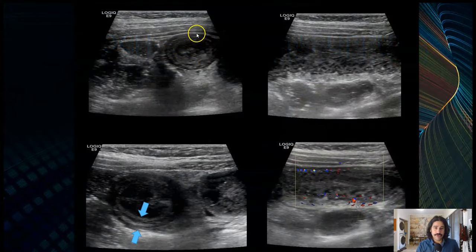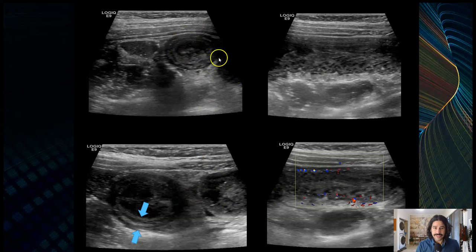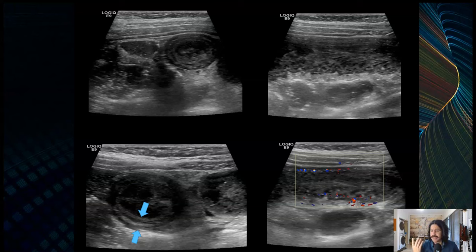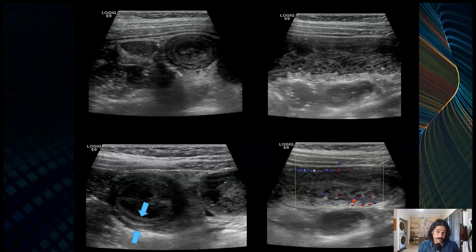Here's a case — small bowel that's very thick. You can see the gut signature; the submucosa is the echogenic middle layer. The bowel looks like a donut — it's thickened throughout, especially in the hypogastric region. I had a case a few weeks ago where I noticed bowel wall thickening on an abdominal complete ultrasound, and I checked the legs — sure enough, there was a rash. I told the radiologist, who told the ER, and the patient turned out to have Henoch-Schönlein Purpura. It's good to know these things — otherwise it would have been a normal abdominal ultrasound.